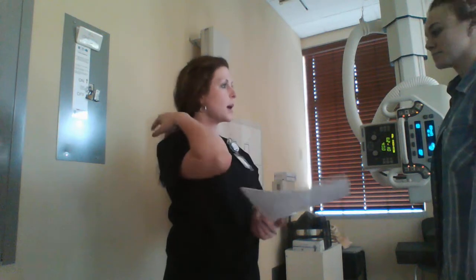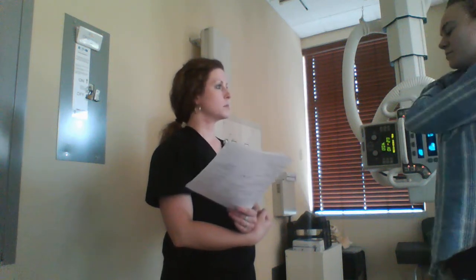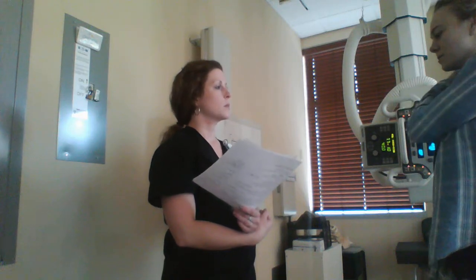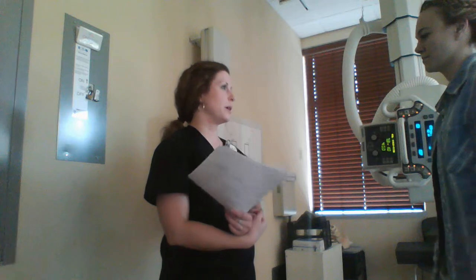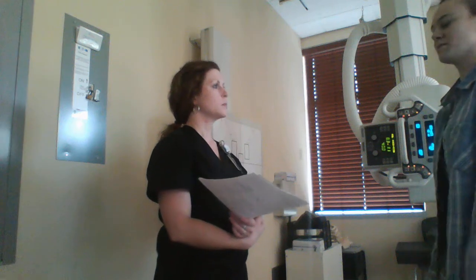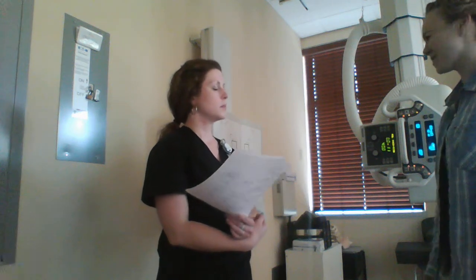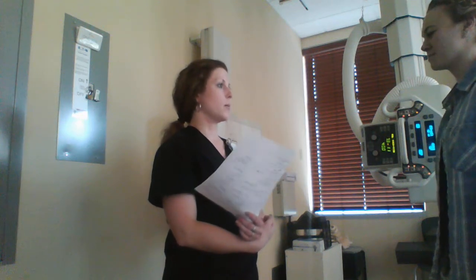So we're taking two x-rays of your scapula. Can you tell me what happened? Yesterday I was getting out of bed and I just slipped and fell and hit my scapula right onto the bedroom floor. On a scale of 1 to 10, how would you rate your pain? Probably about an 8 right now. Does anything make it better or worse? Some ice makes it feel a little better. Movement makes it feel a little worse. Is it throbbing or achy? It's kind of like a throbbing pain.